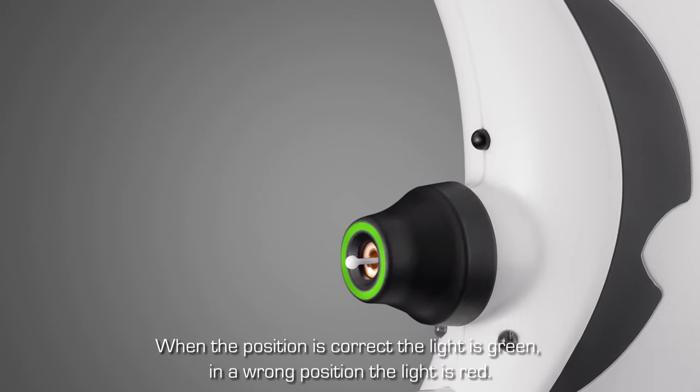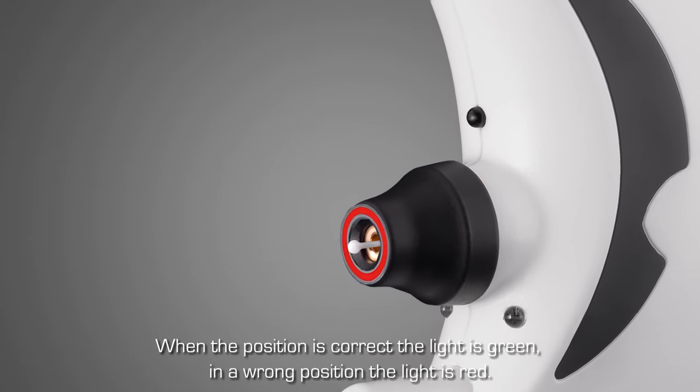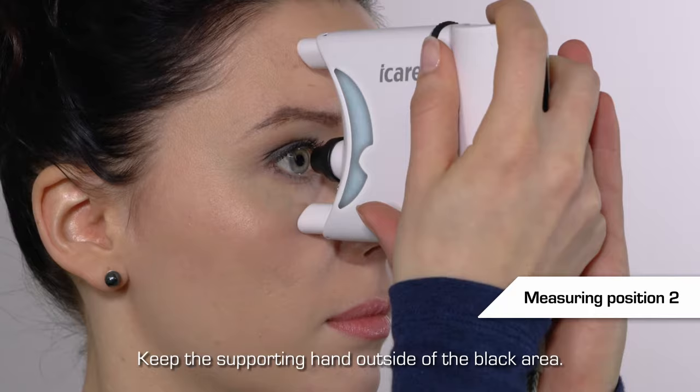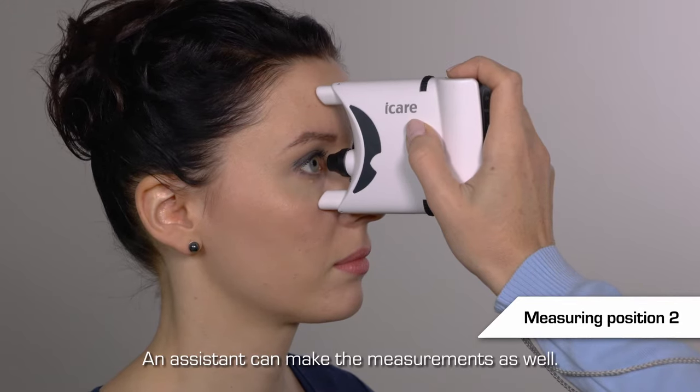Measurement can be performed when there is a green light in the probe base. A red light indicates wrong positioning. If you measure with both hands, your supporting hand must remain outside the black area. Measurements can also be made by an assistant.